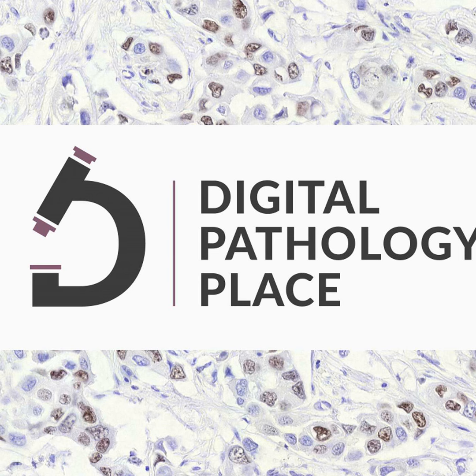What do they call the overall performance? So you put all those categories together, and if most of them are good, it's going to be high. But clearly, the benign tumors are underperforming. So if it was me, I would lump all the tumors into tumor and then give it to a pathologist.